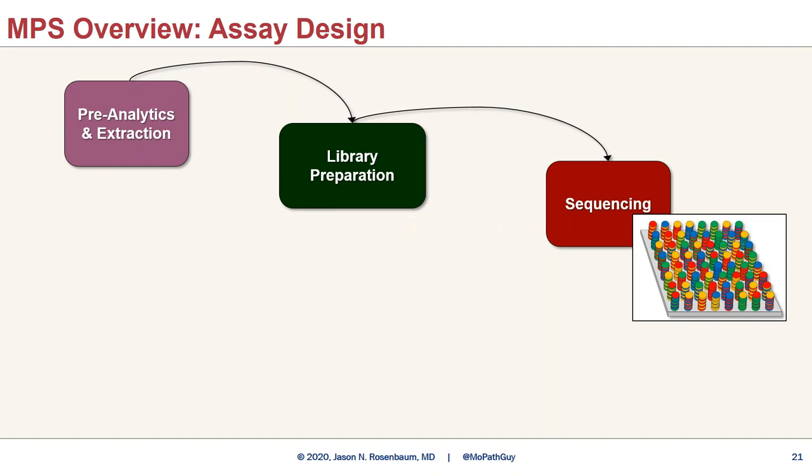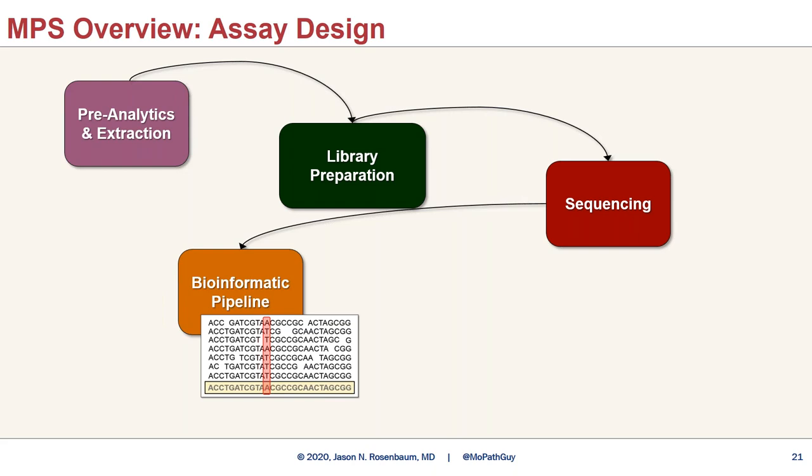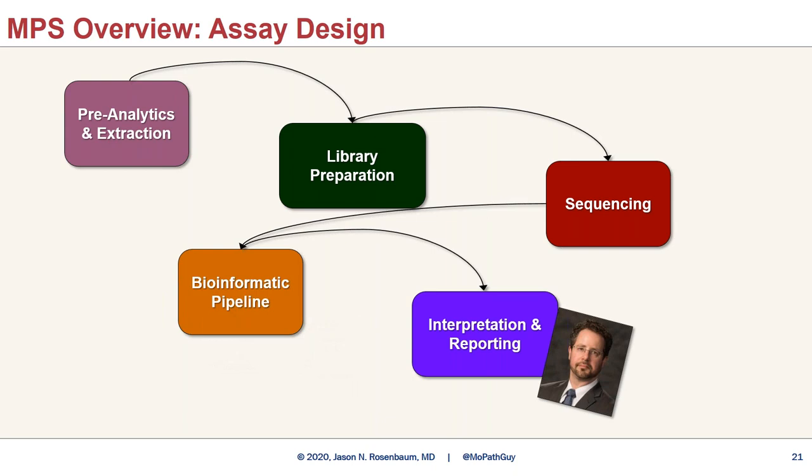And often, if someone is giving a next-gen sequencing lecture or a massively parallel sequencing lecture, this is what they would focus on. But at the end of the day, actually, the sequencing technology doesn't really make that much difference. We'll talk about it a little bit, but it doesn't make a huge amount of difference to the outcome of your assay. Much more important are the bioinformatic tools that comprise the bioinformatic pipeline. We will spend some time on that on Thursday and then proceed to talking about interpretation and reporting.